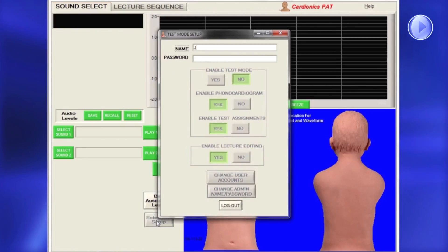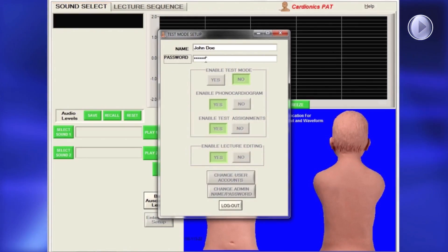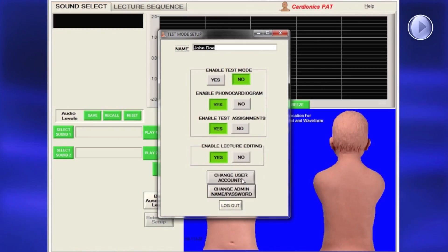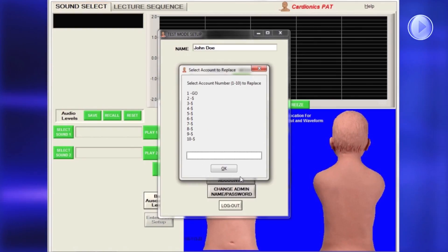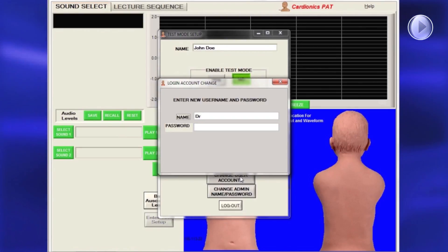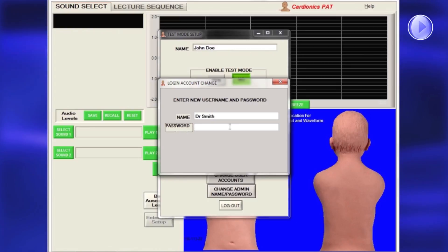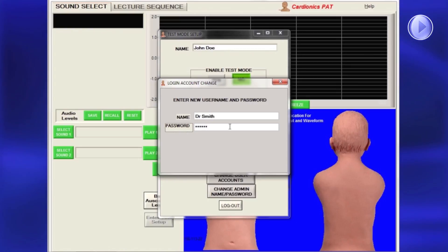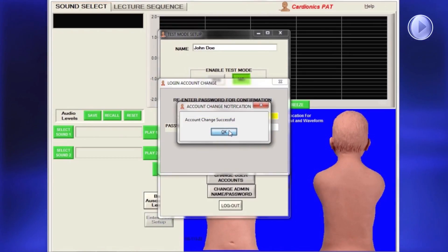A password is required for instructors to edit lectures or use the Student Assessment Program. To add an instructor, click Change User Accounts and the Select Account page will appear. From the list of instructors, enter the next available number and press Enter. A dialog will appear for entering the new name and password. You must confirm the password by entering it twice. The new instructor's name will now appear in the list.